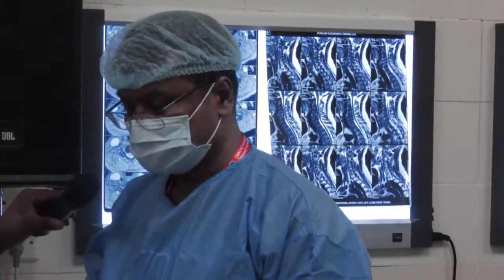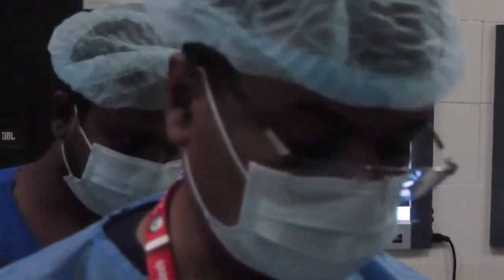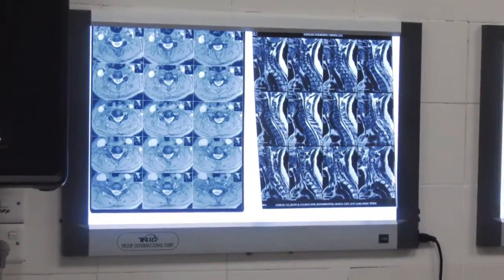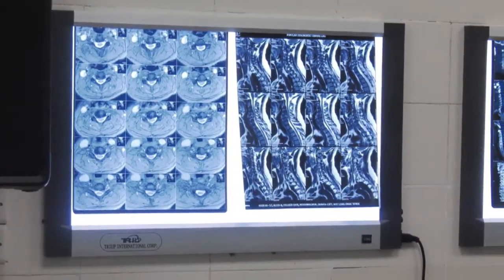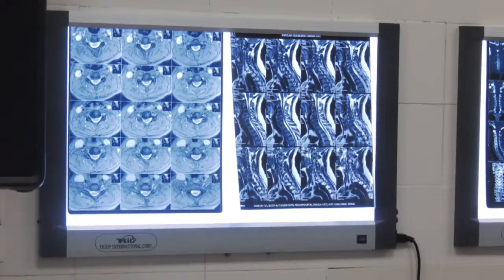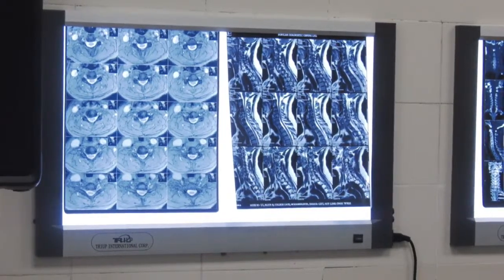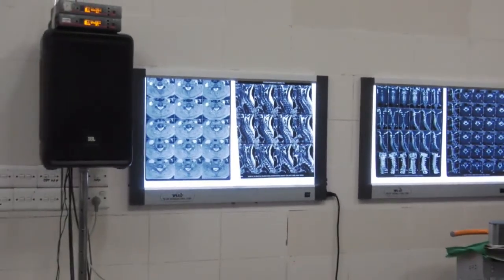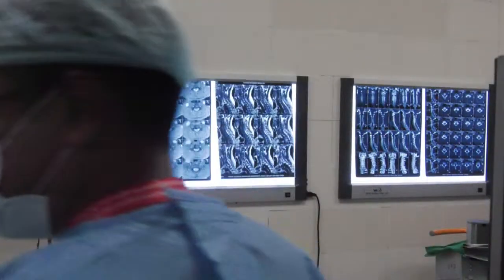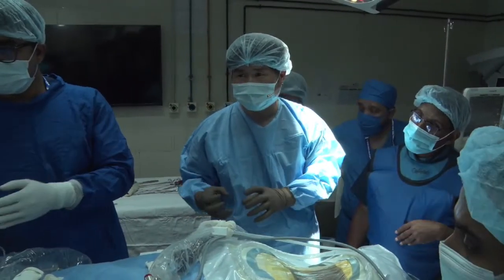Today I am also doing the partial pediculotomy, posterior PCF, but today we prepared not the small scope, only the large scope. Because of that, partial pediculotomy is possible, but partial vertebrotomy is not possible, because partial vertebrotomy usually inserts working sheaths, protects the nerve, then drills the vertebral body, and this working sheath is very huge.